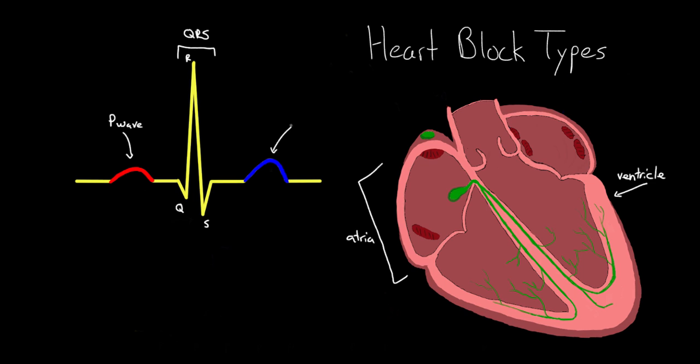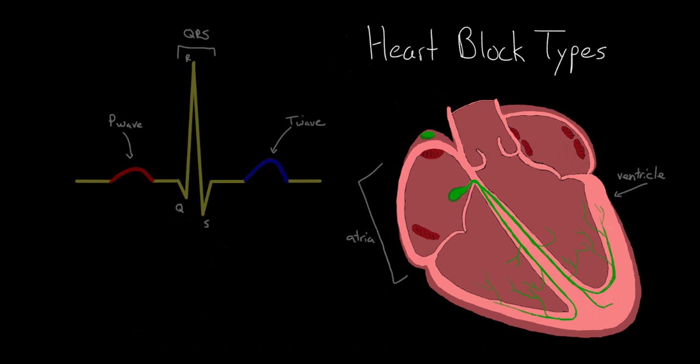After the QRS complex comes the T wave, and the T wave doesn't reflect a contraction of the heart, but rather it's the repolarization of the left ventricle as it regains its electrical energy.